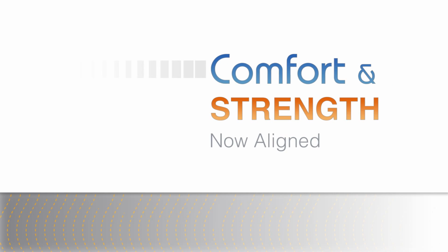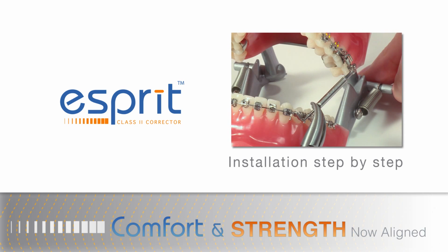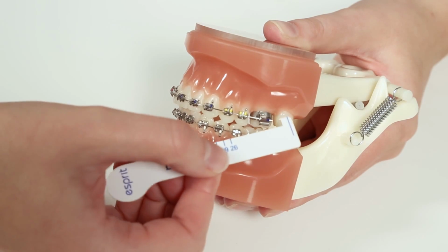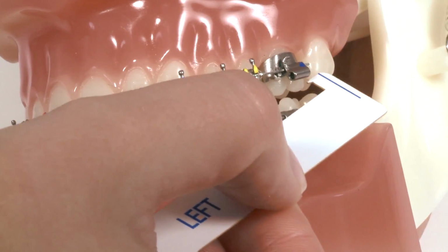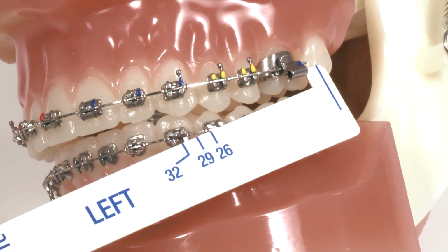Installation of the Euclid pin version of the Esprit Class II corrector is fast, simple, and convenient. Using the Esprit measuring device, place the hook into the distal end of the headgear tube. Measure distal from the upper first molar headgear tube to distal of the lower cuspid.